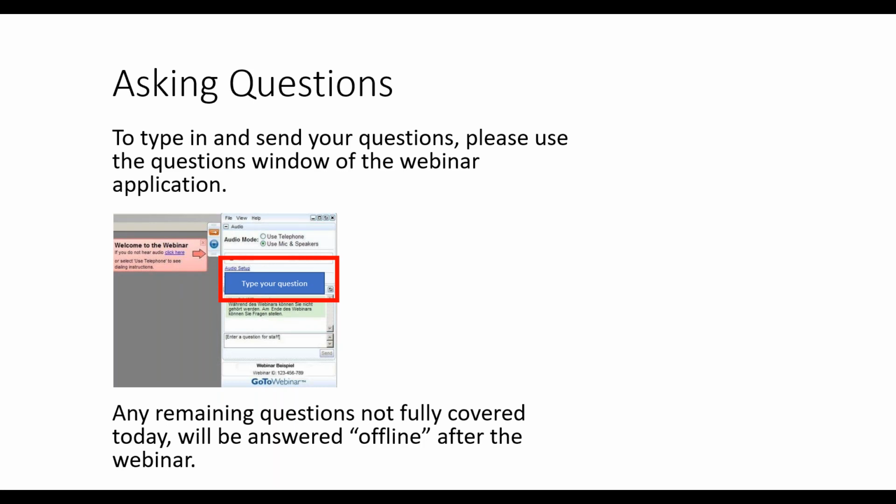Well, central serous retinopathy is a complex disease, and it depends whether you are treating the first attack or if it is a recurrent disease. How long has the disease been there? We need to look at the status of the retinal pigment epithelium and the pumping activity. So there are many factors. As we know, the Navilas system uses a 577 wavelength, so that is to be used. And again, I'm using a 5% duty cycle with all micropulsing, 0.3 seconds.